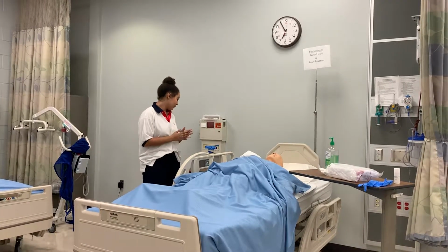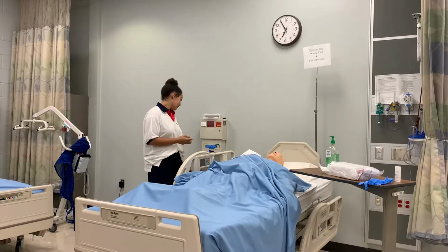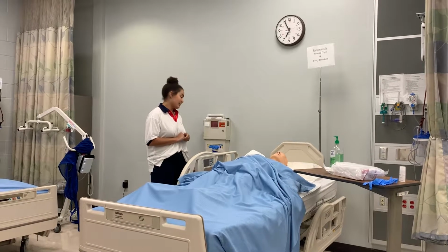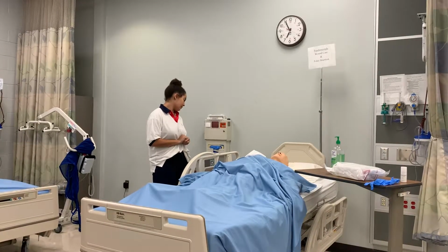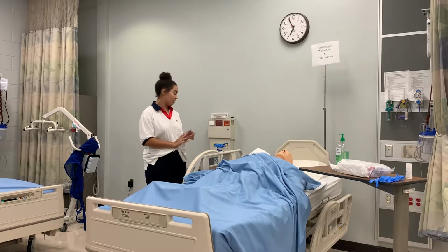So we're going to be inserting a Foley catheter to Mr. Fundamental here because he has been unable to void post-op, and he has some bladder distension. There's about 150 cc's from the bladder scan. And so I'm going to educate him on the insertion of a Foley catheter and why we are doing it.